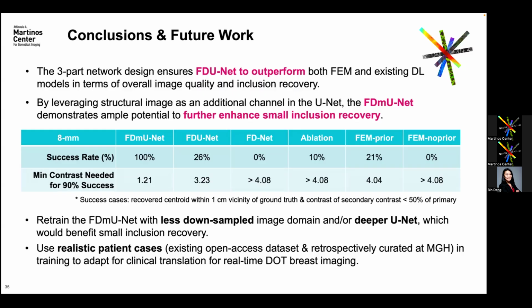So your first attempt was using the fully connected layer to go to the image domain, right? Yes, at the beginning. At that point, were you labeling what the image should look like at the first layer, or did you just have a fully connected layer and then subsequent layers doing analysis? No, we don't have that. For the fully connected layers, we don't have explicit information on where this optode is and where the corresponding image space is. The relative positioning or spatial distribution is learned. We didn't give any instruction on that.